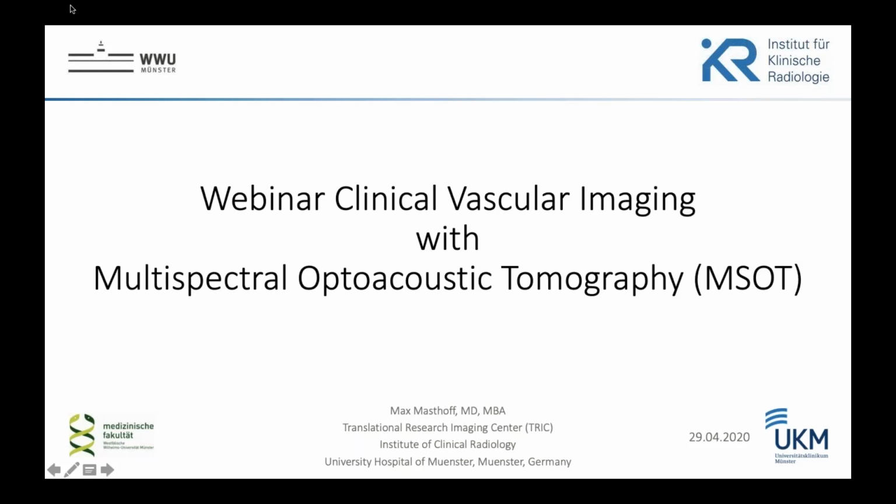We will start from the beginning, since I was told there are most probably some clinicians in the webinar who are not too familiar with optoacoustics. I will start with a brief introduction to the technique, which most of you will know. MSOT relies on the optoacoustic effect, which has been known for a long time.